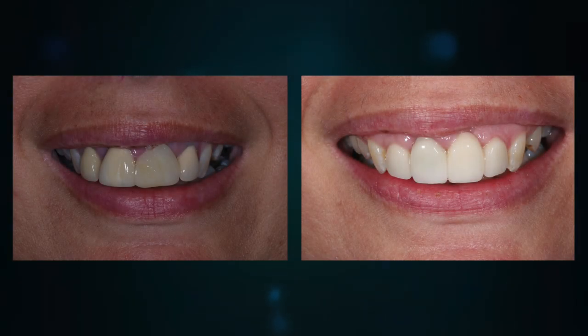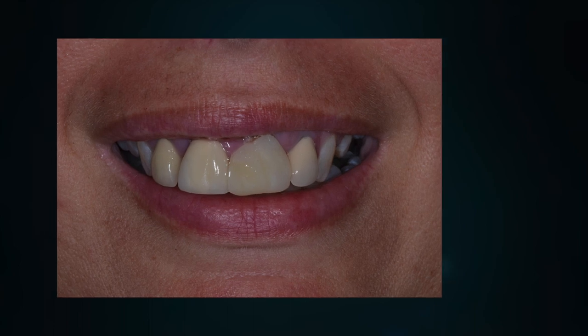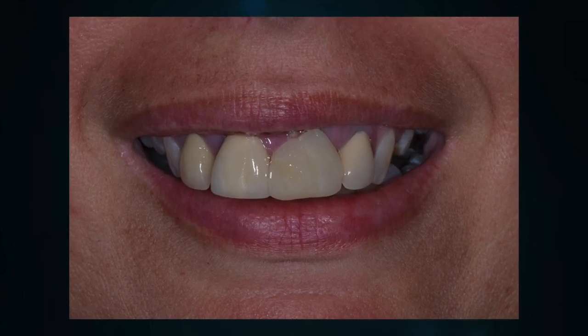These are the before and after photos. You can see the main reason this patient came in was her front tooth, which some dentists had built up on a temporary tooth. It's really prominent, really obvious, it looks horrible. You can see just underneath this thing there is a tooth stump. This tooth was unrestorable, so the tooth had to go. Her big thing was she wanted to bring her teeth back and just have a nice looking upper set of teeth.